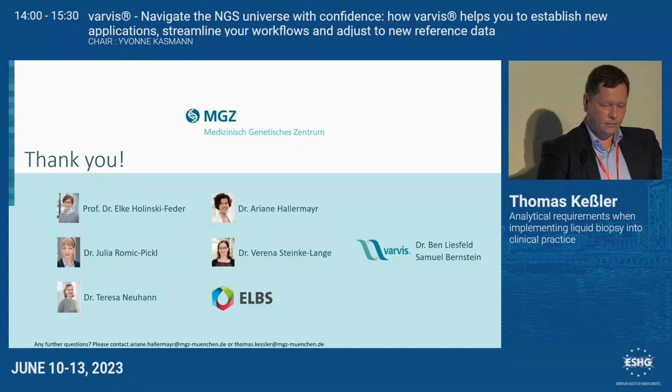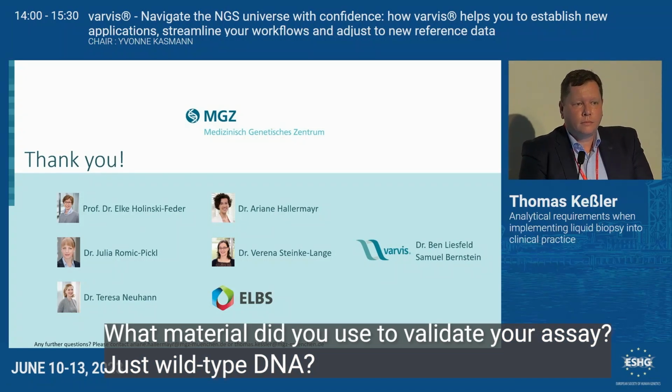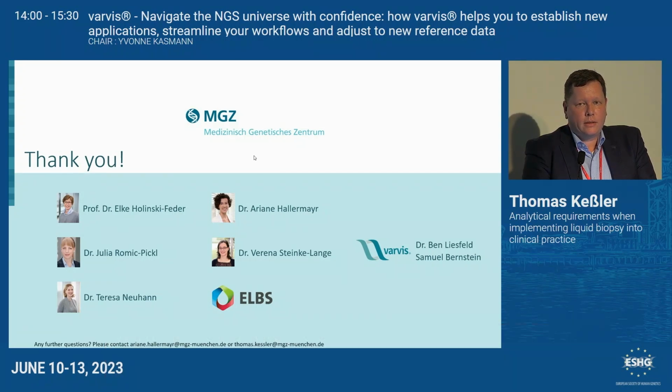Any question that you would like to ask now? What do you use for determining your limit of blank? Is it just wild type DNA? No, it's actually Genome in a Bottle. So these three reference materials are all based on this material.